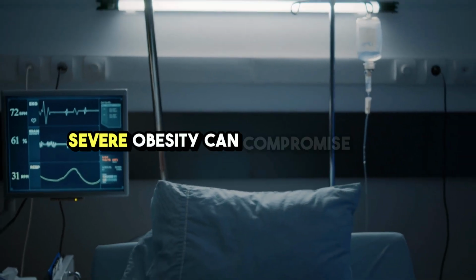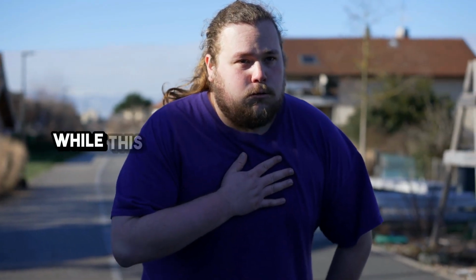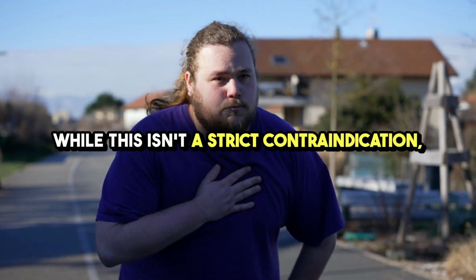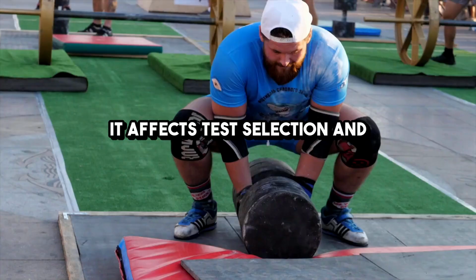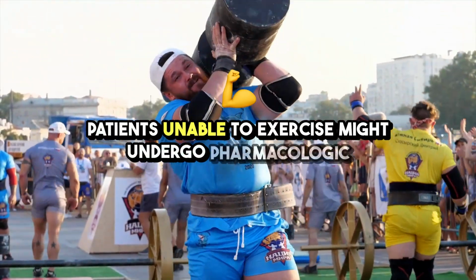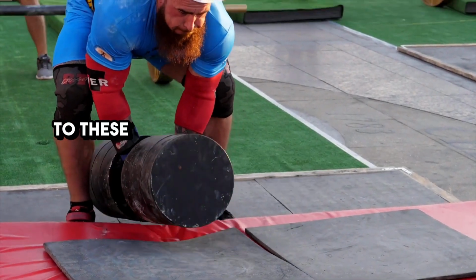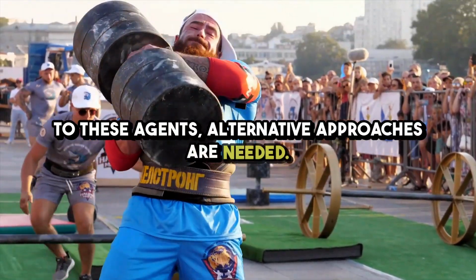Severe obesity can compromise image quality, leading to suboptimal results. While this isn't a strict contraindication, it affects test selection and interpretation. Patients unable to exercise might undergo pharmacologic stress testing. However, if they have contraindications to these agents, alternative approaches are needed.